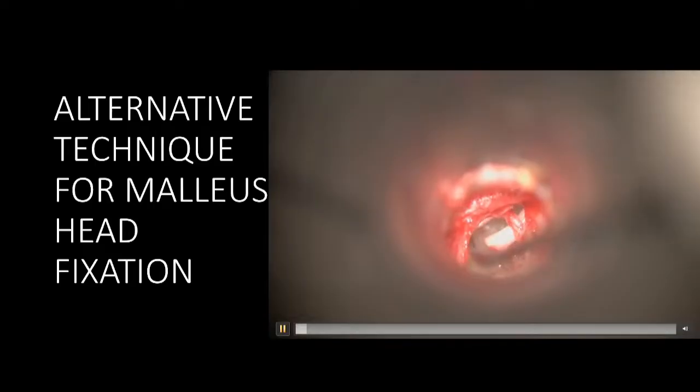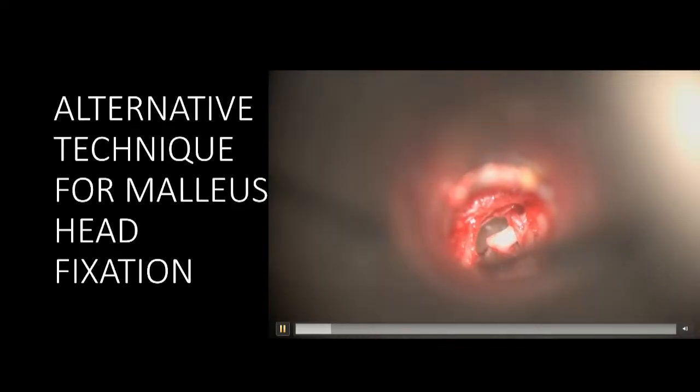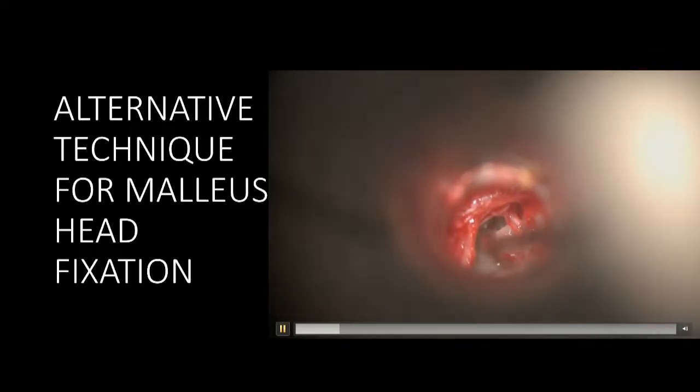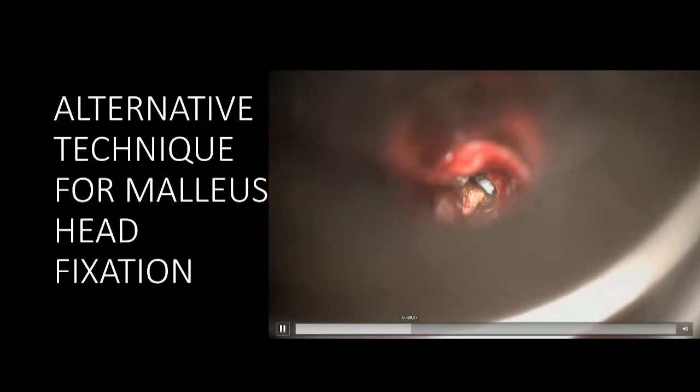This is how it looks. Sorry, my microscope is a little bit overexposed. Our microscope is getting old. We need cameras. All right, so what we've got there is a mobile stapes, but a fixed malleus. For sake of time, let's just fly through that and show you basically.